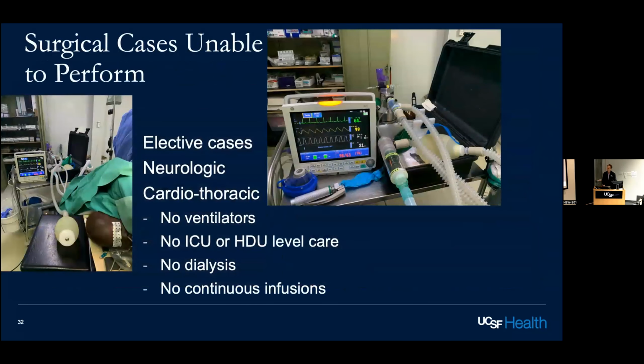You're looking at the Diamedica draw-over anesthesia system. The thing's a workhorse. It's extremely simple, so therefore nothing breaks on it. And that's the extent of your monitoring. So that's kind of state of the art for Ben 2.